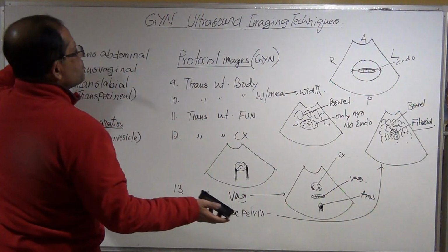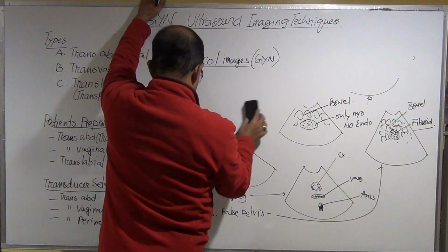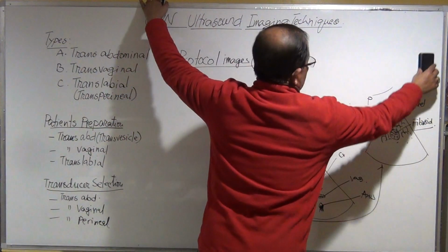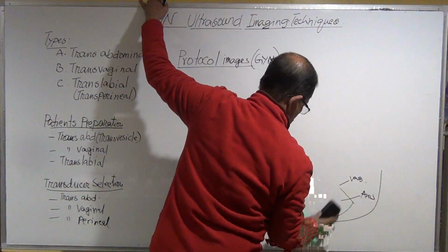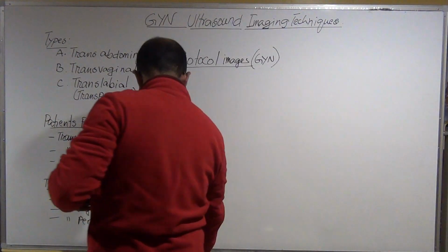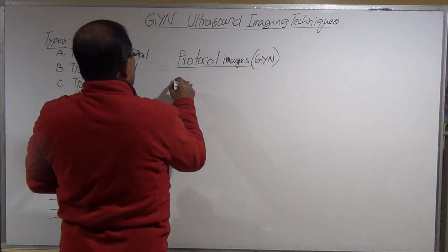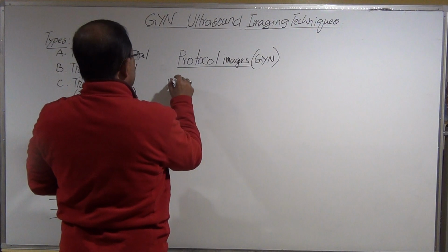So now let me give you the protocol pictures of the ovaries. Now it was 14, now it's 15.